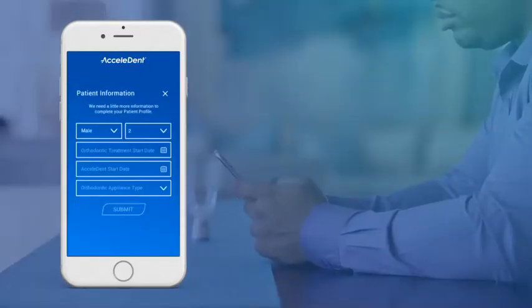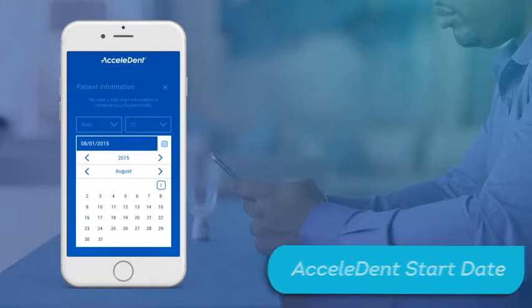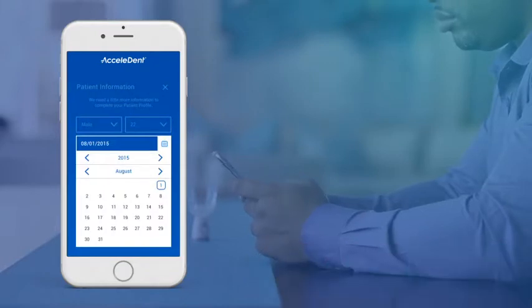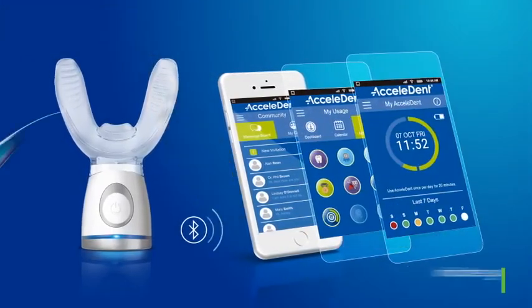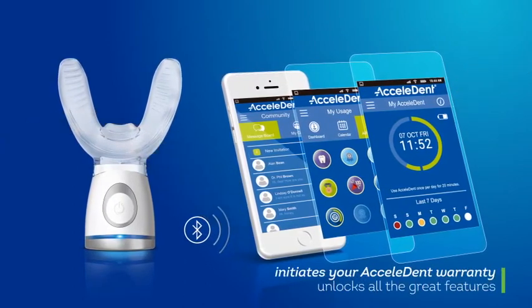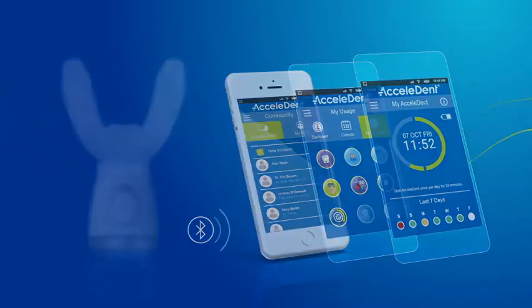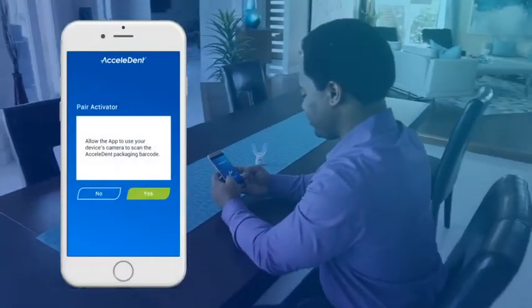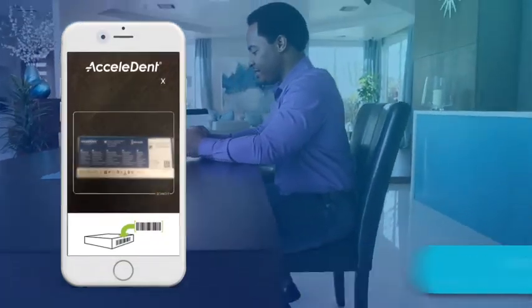Patients, enter your profile information including your Accelident start date. This date is important as it will be used to calculate your dashboard rank and achievements. The Accelident app works by connecting to your Accelident Optima via Bluetooth. Pairing initiates your Accelident warranty and unlocks all the great features the app has to optimize your treatment experience. To pair your Accelident Optima, allow the app to use your device's camera to scan the Accelident packaging barcode.